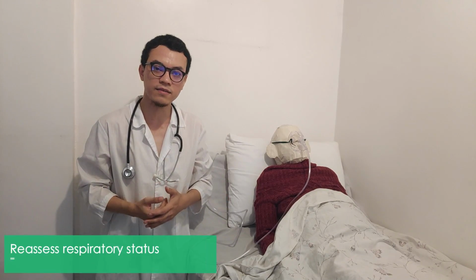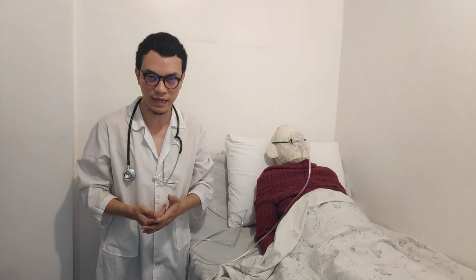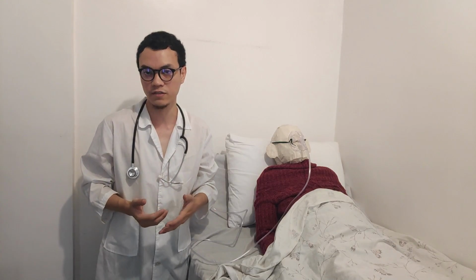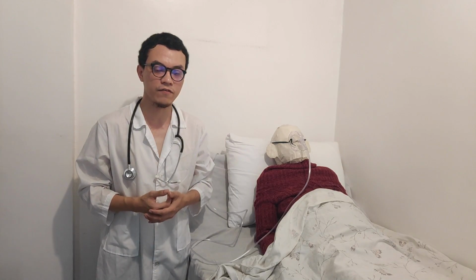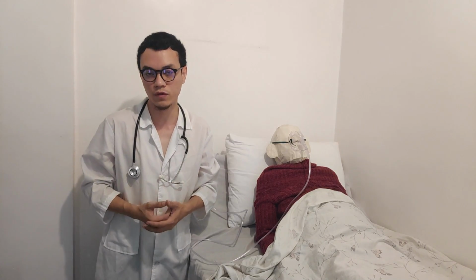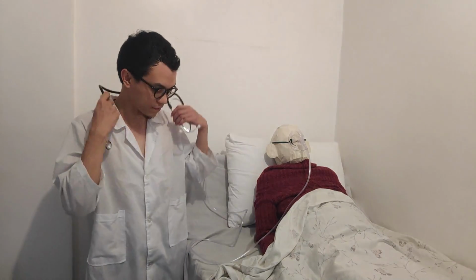Next is reassess the patient's respiratory status, including respiratory rate, effort, and lung sound. Note for any kind of respiratory distress like tachypnea, nasal flaring, and use of accessory muscle.